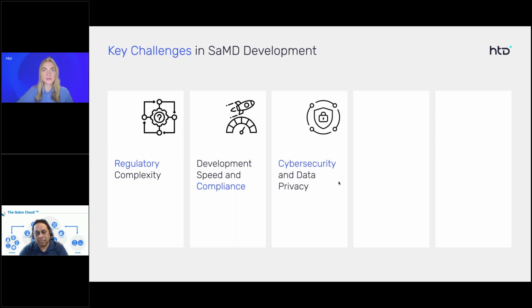So, cybersecurity and data privacy. In today's world it's really important to protect patient data when developing software as a medical device, with strong encryption, regular security audits, and a plan for handling security breaches.